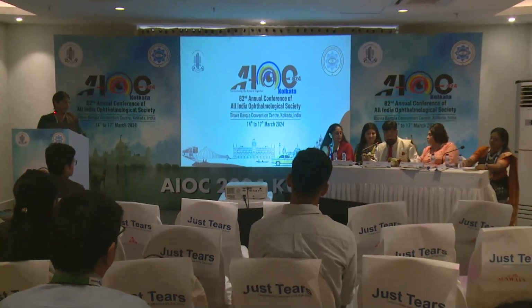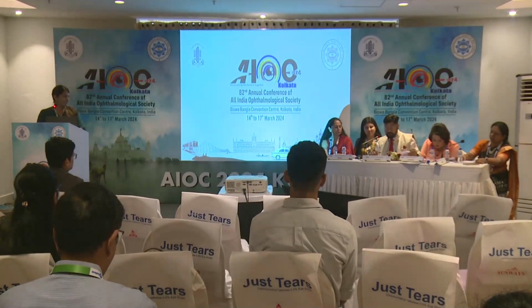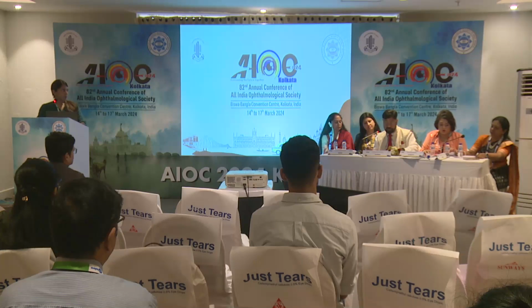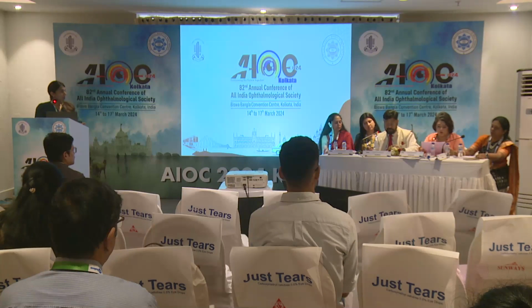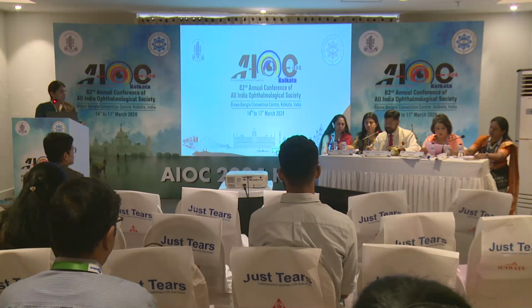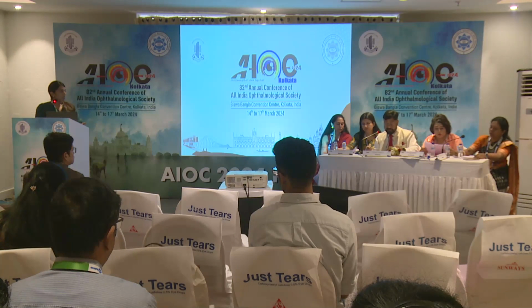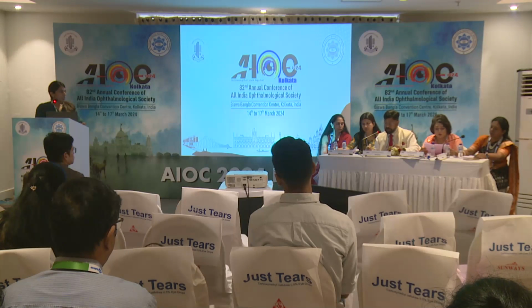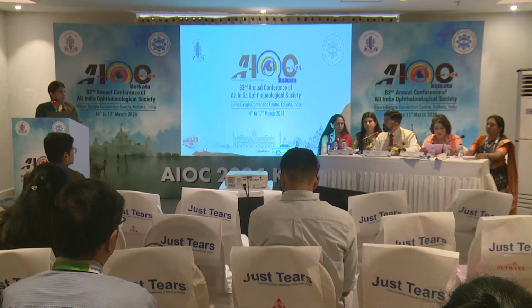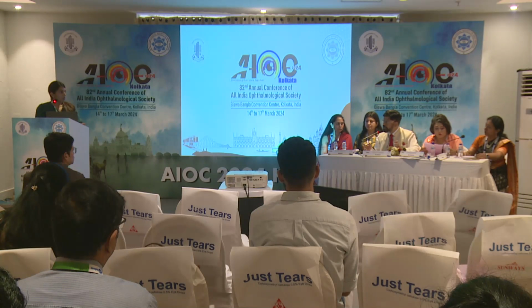Good, Dr. Niranjana. I find that there's a difference between Argos and the IOL Master 700. You said that the overall length measured by Argos is a little less than what you measured in the IOL Master 700, and especially the ACD is very significantly high in Argos. Could you find out the reason for what is happening?